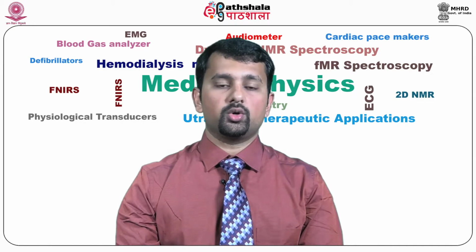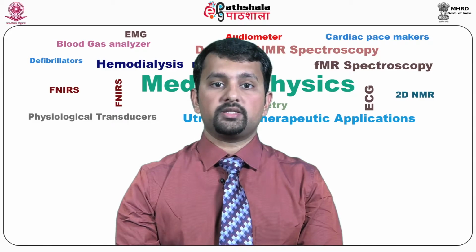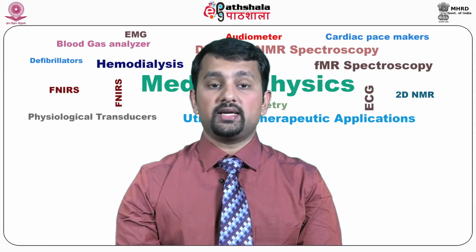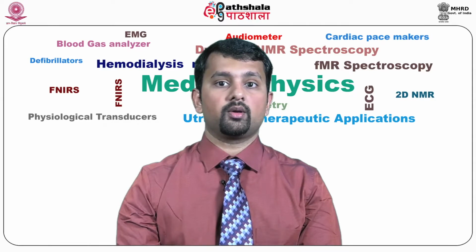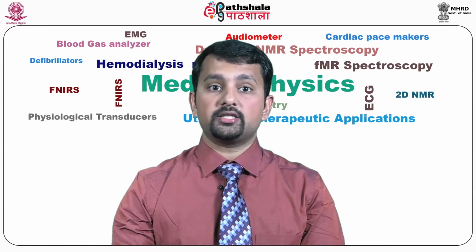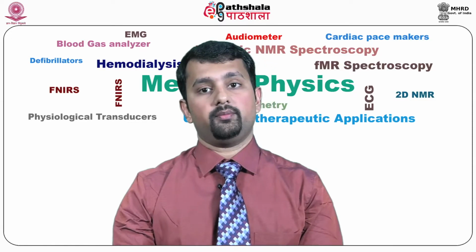Proton MR spectroscopy is a very good supplement to MR breast imaging, which significantly increases the positive predictive value of biopsy as well as decreases the number of biopsy recommendations for benign lesions with non-mass enhancement. It also has applications to monitor or even predict response to treatment in patients undergoing neoadjuvant chemotherapy.